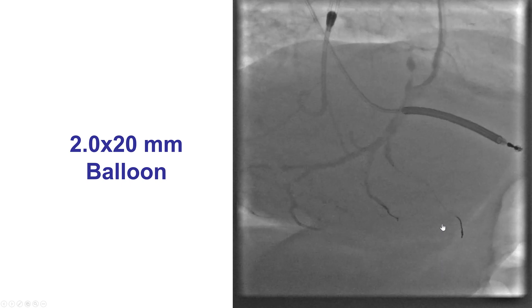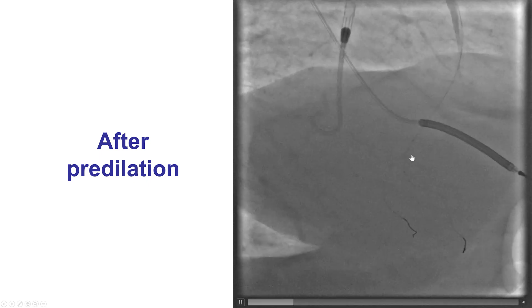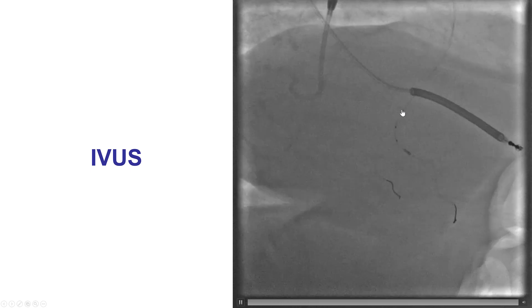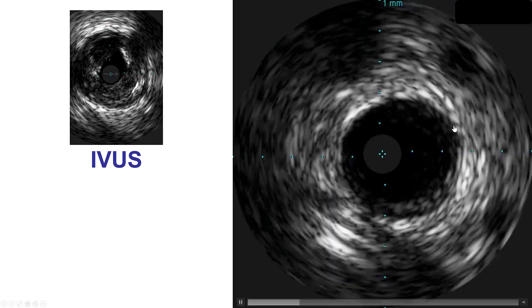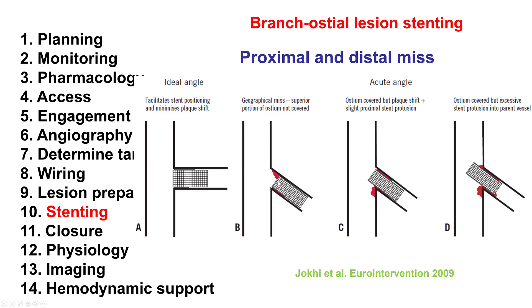We then predilated with a 2.0 by 20 mm balloon, which improved the stenosis. We now had a branch ostial lesion to treat, and one of the challenges is how to avoid too much stent protruding into the main vessel. IVUS showed the vessel was actually 3.5 mm — a fairly large posterior descending artery. What we want to avoid is going completely into the vessel and missing part of the ostium, which can lead to ostial restenosis. We want the stent coming partially into the main vessel to completely cover the ostium, minimizing the risk of restenosis. The distal RCA was fairly large, so this should not be a problem.